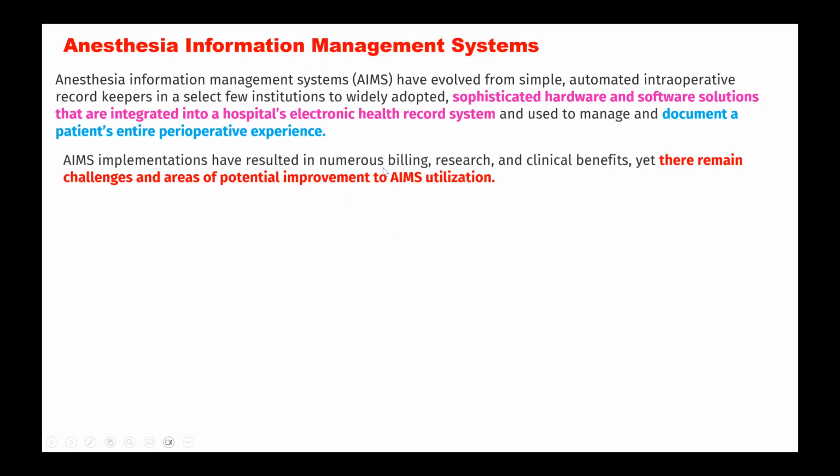And it has also helped in the administration by billing, research, clinical benefits, and the challenges. It also helps to improve your management of the patient by going through the records and then having a discussion or a debate on how to manage critical cases. So it also helps in improving the standards of care of the patient.